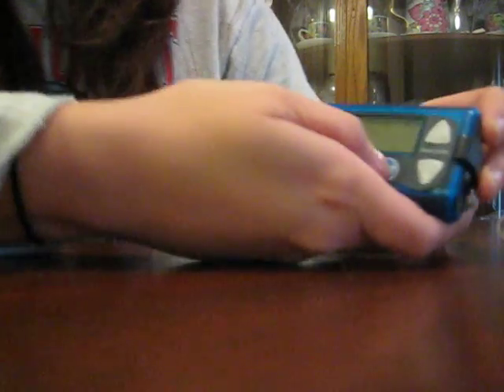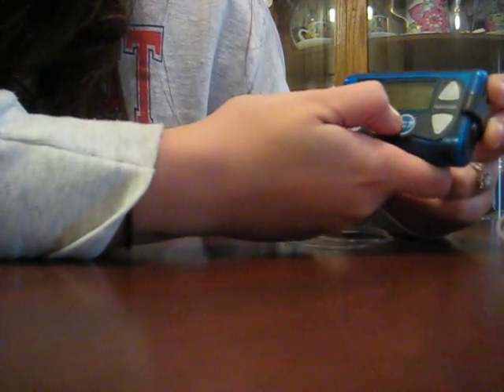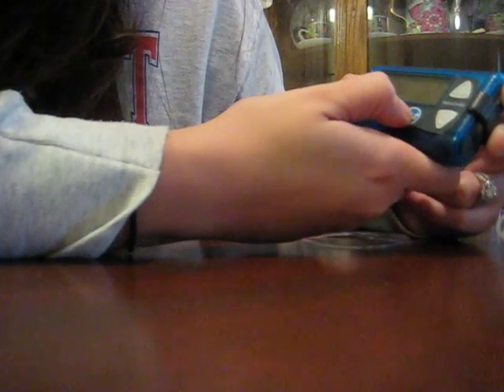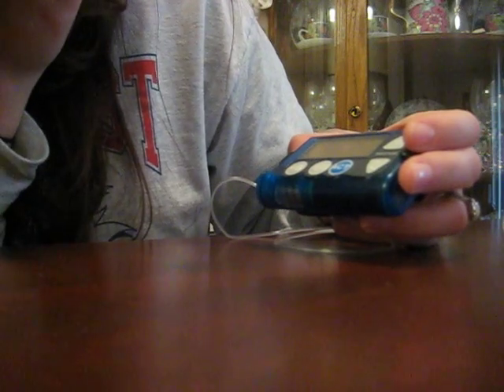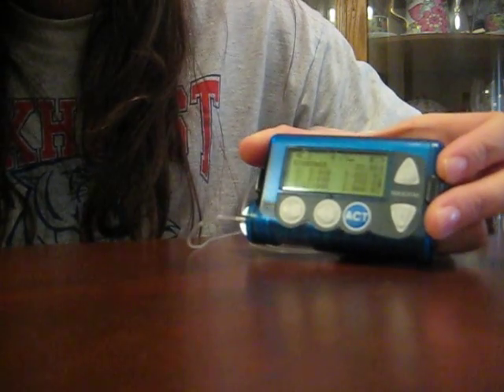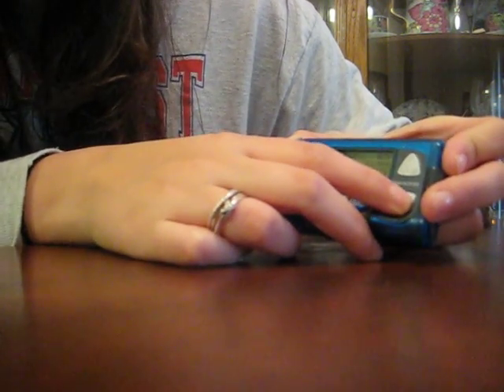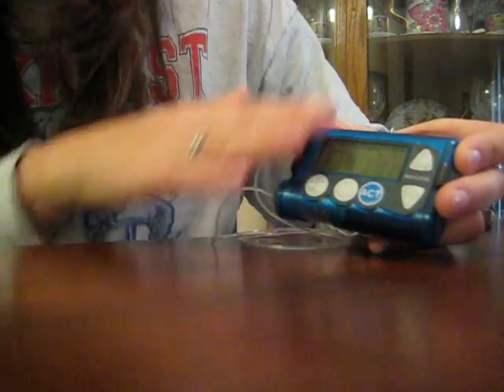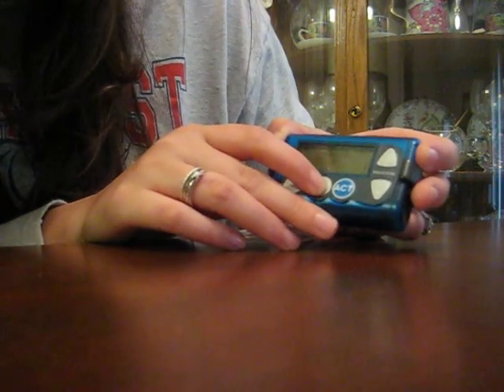What you do is you have basal rates — I hope you can see this. These are all the different amounts that it gives me during the day. For example, from 8 a.m. to 11 a.m. it gives me 1.45 units an hour, spread out over every hour. There are different amounts for different parts of the day — I take less at night — and it just does that on its own without asking you. That's what keeps you just regular.